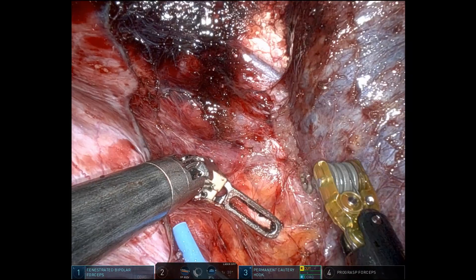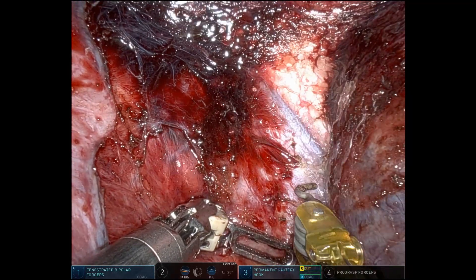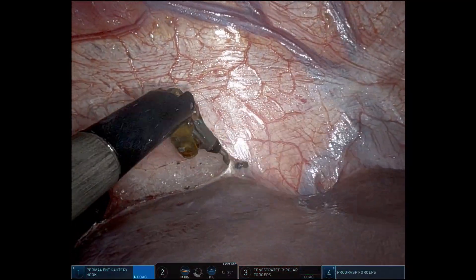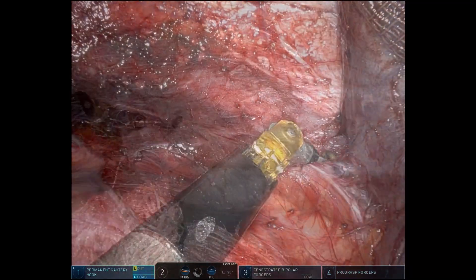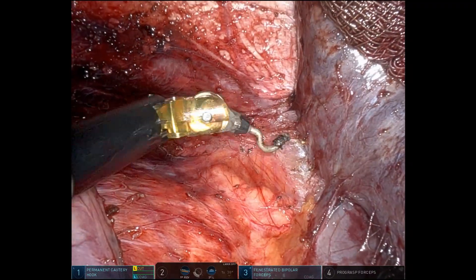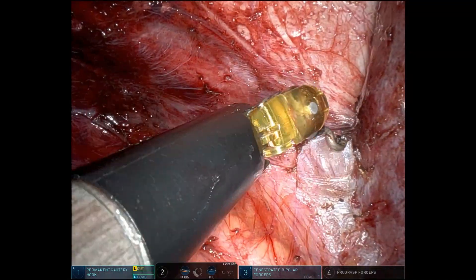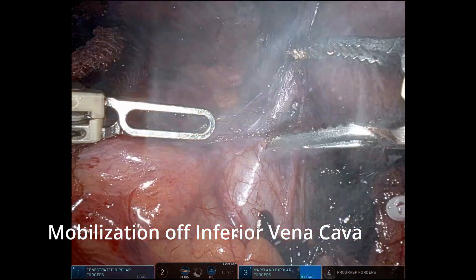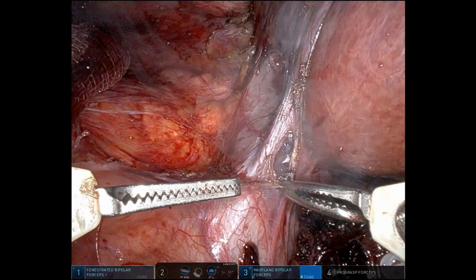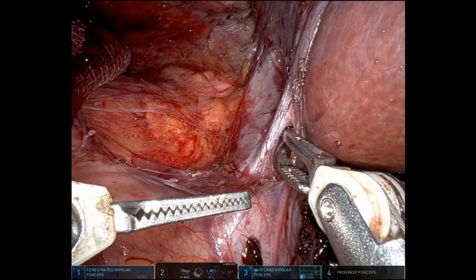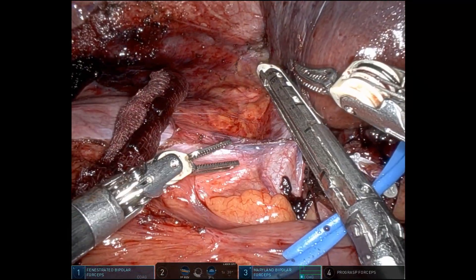Here we are continuing the mobilization until we see the cava. You see the cava there on the inferior aspect of that image. Continuing the mobilization all the way up to the right hepatic vein. You can see the short hepatic veins draining straight into the cava. We'll take those shortly. We still use a lot of pinch burn to isolate these structures — the small ones with pinch burn, the larger structures with either a vessel sealer or clips. One was sizable enough that we divided it with a vascular stapler.